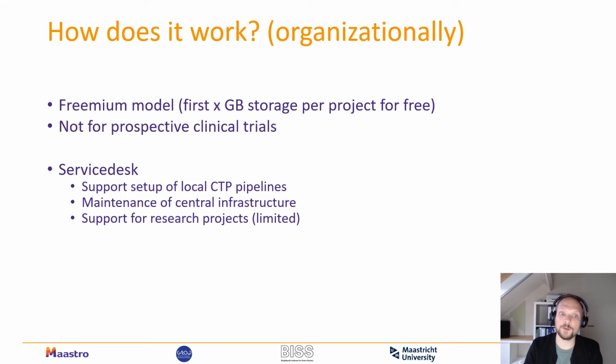If a hospital comes back for a second research project, we will probably reuse the CTP script made for the first project, but we will go through the whole testing or QA procedure again, to make sure that nothing has changed, also in terms of scanning parameters and scanning settings, which mean that different DICOM images can be generated.